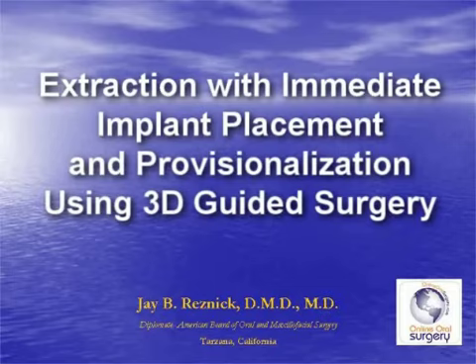The next evolution of this was when we started placing provisional restorations on the implants at the time that they were placed. And this was usually done for a single tooth implant or sometimes for a short span. And again, the success rate really was very minimally affected as long as strict protocol was followed. And we also had the benefit of improved soft tissue aesthetics, especially in the anterior region, when we placed a provisional restoration at the time that the implant was placed.